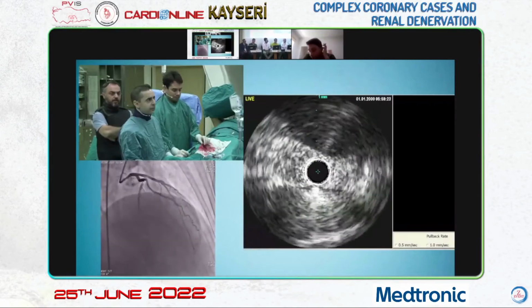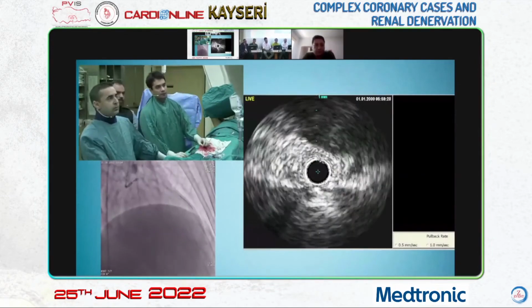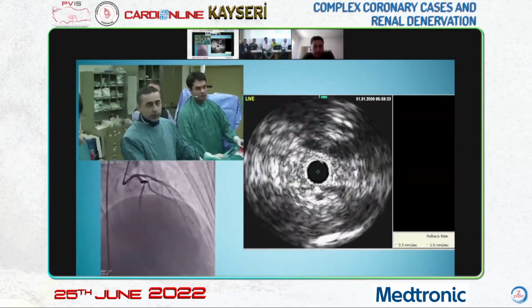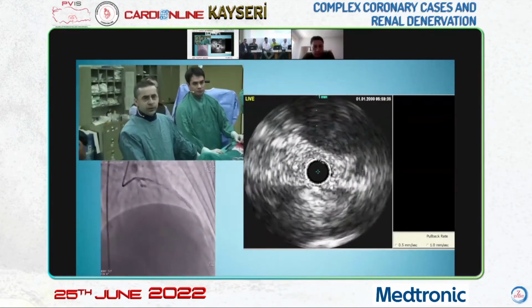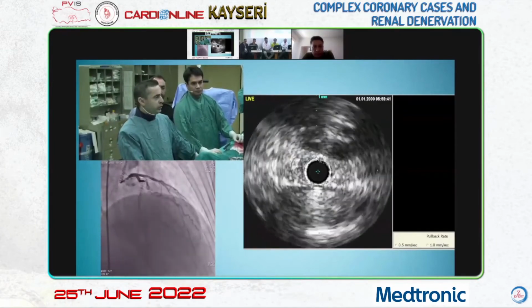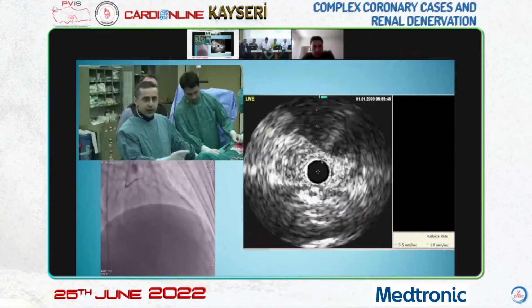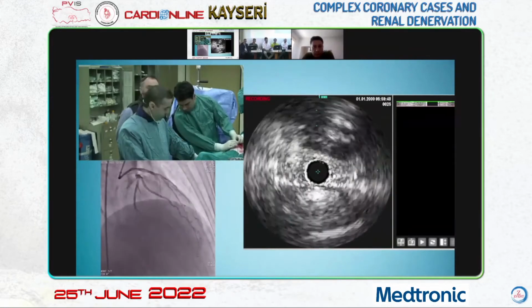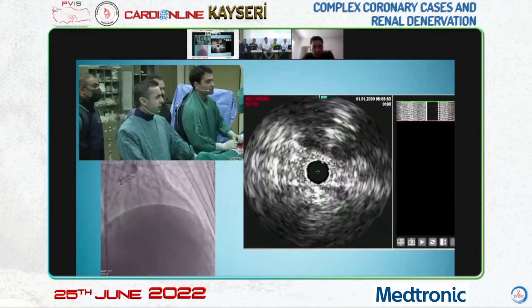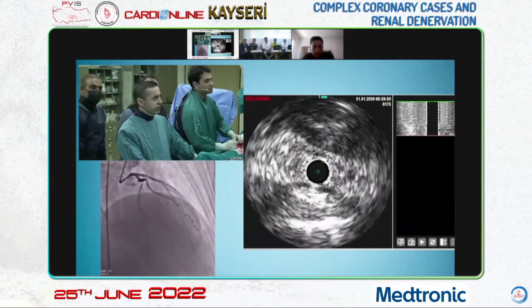The most important here is a small diameter stent, which may cause stenosis. Do you see the IVUS? Yes, we can. There is no lumen in this distal part. And in IVUS, the area is 2.3. We will pull it back now with a scope. Pull it back now. There is no lumen, you can see.